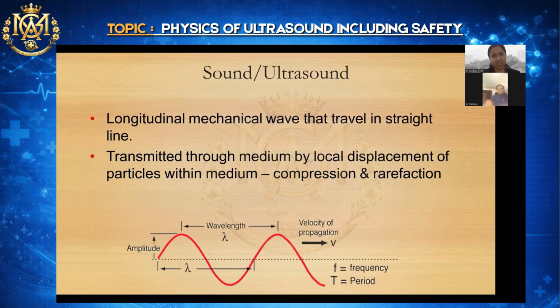Okay. Having said that, ultrasound is a sound wave. When I'm telling you that it's a sound wave, that means that it travels like a mechanical wave in a straight line. Please read this line: longitudinal mechanical wave that travels in straight line. Every word in this sentence is important. Second point, it needs a media for transmission. That is why you use the gel which you put. If you don't put the gel, the sound wave will not transmit.